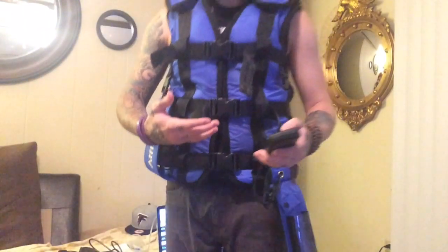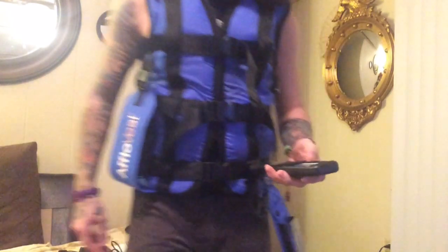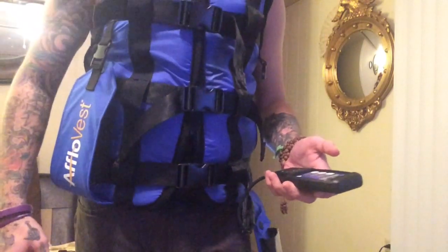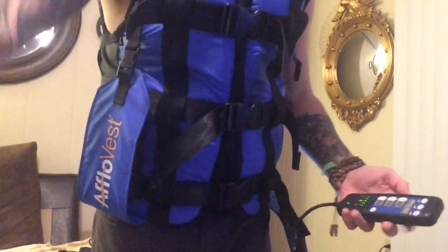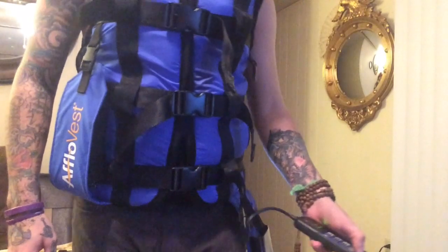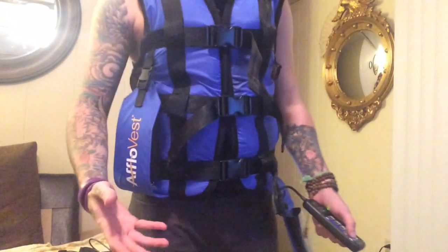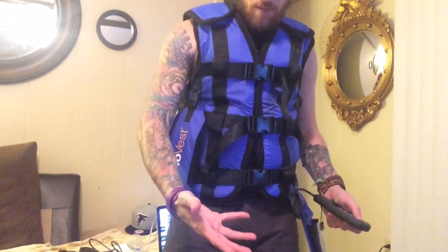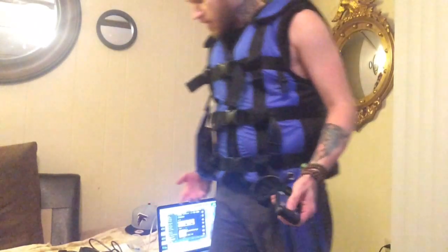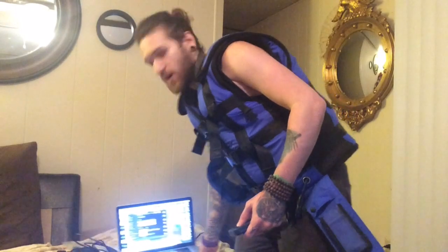We're going to start out with vibration. The vibration is like a normal vest would be — just a constant vibration. The vest is on right now and this is on low. I'm going to crank it up to medium. If you can't tell already, this vest is super quiet compared to the Hillrom vest. You may be able to hear that I have the robot voice going on — that's really the only way you can tell that it's on.